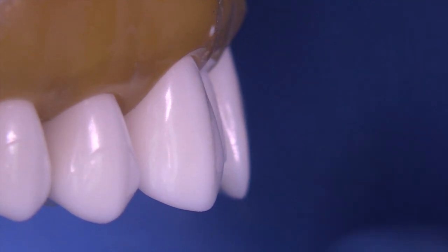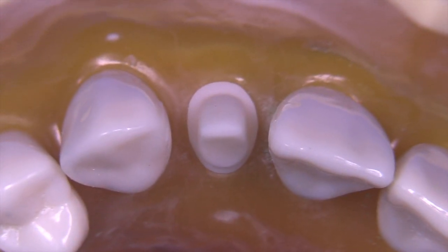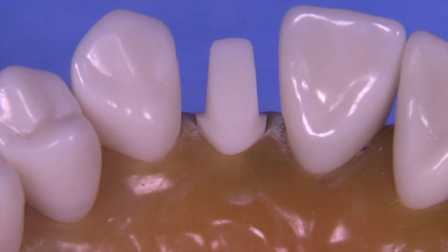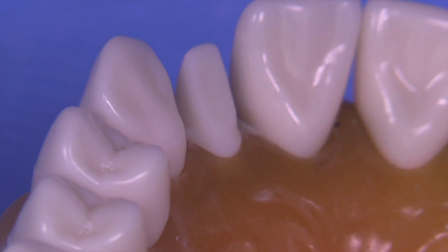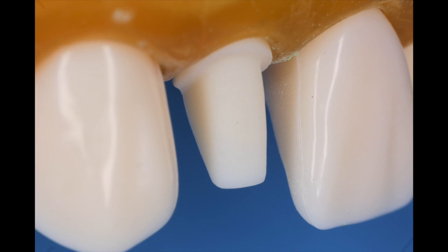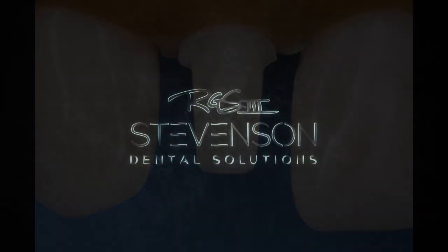I think it turned out okay. At first when we looked at it about five minutes ago it wasn't quite where we wanted it, but I think it looks pretty good at this point — it meets the criteria for passing a PFM preparation. I hope you found this video helpful. I plan on doing more PFMs; one of my followers requested that we do many PFM preparations, so I'm on a tear doing one PFM prep a day for as long as I possibly can. Hope you stick around to see the rest of the series — have a great day!